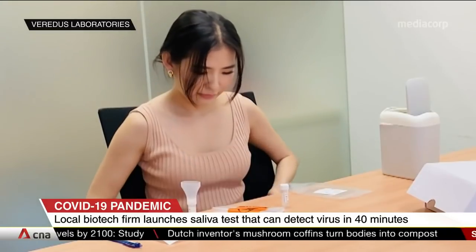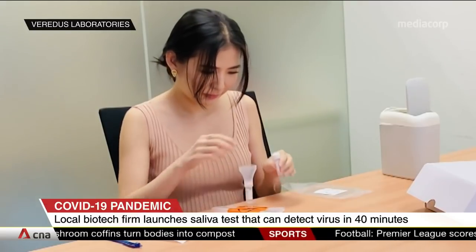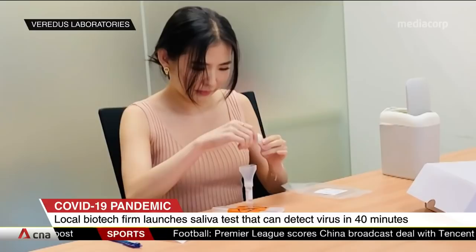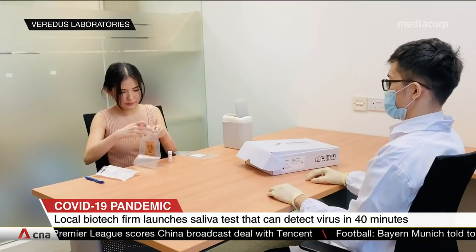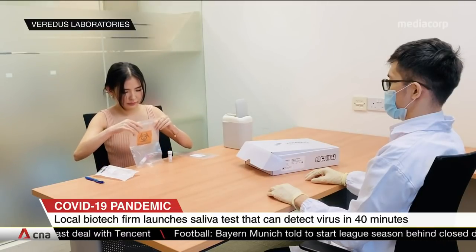The test is done by spitting one milliliter of saliva into a tube. A specially formulated solution is then poured into the saliva sample to preserve the genetic material of the virus. The solution helps to reduce the step of extracting nucleic acid from the sample and cuts down the process by around 30 minutes.